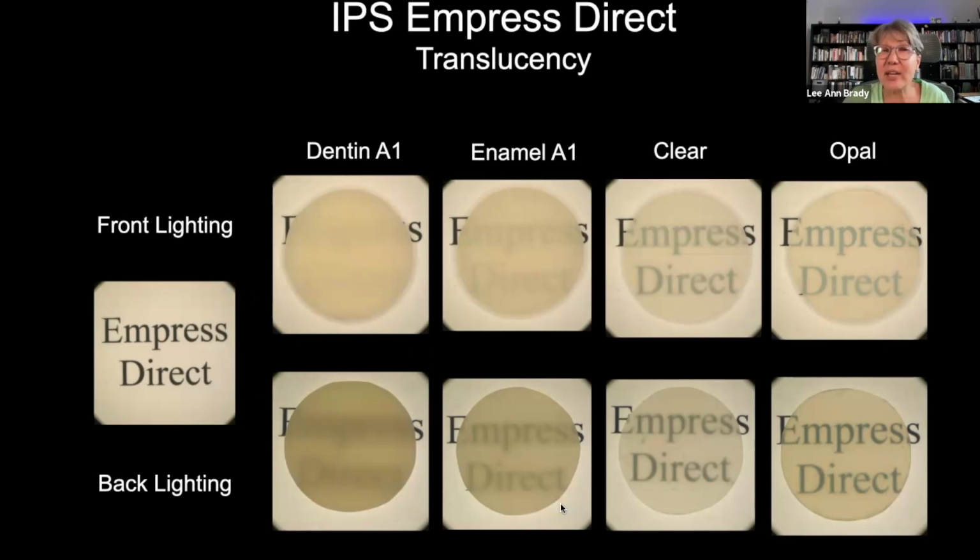We'd almost say they're 80% translucent, which is way more translucent than real enamel or real dentin. And as I said, none of the composite systems mimic the translucencies of the actual tooth structure they're named after exactly. Okay. So, this system, the Empress Direct system, is actually pretty close for those of you who use Filtek Supreme. What they call their body shade is pretty much equivalent here to the dentin opacity, their enamel shade, and then they have characterization. All right.